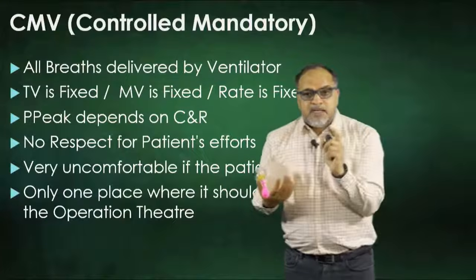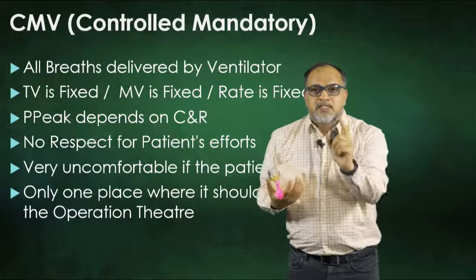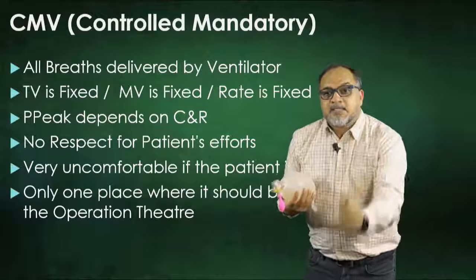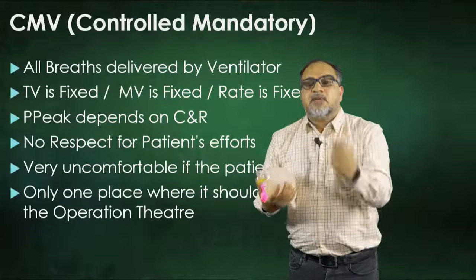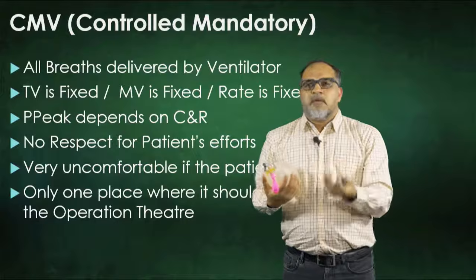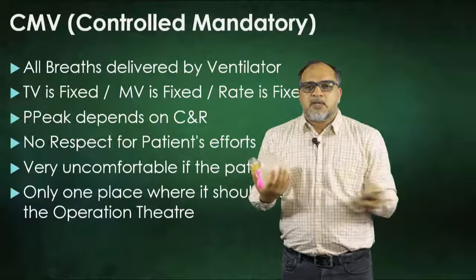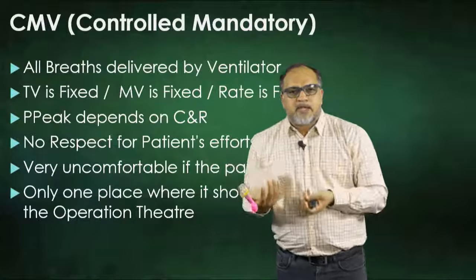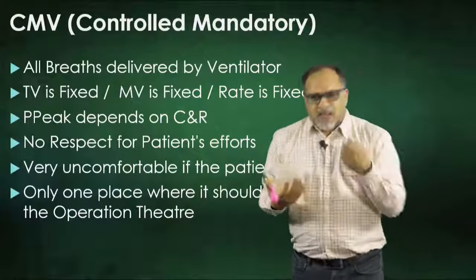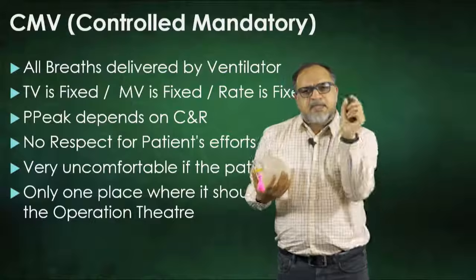The only place where it should be used is the operation theatre, because we sedate and paralyze our patient and we control every breath. In ICU, CMV should be given maybe to a person who is completely comatose and probably not going to wake up anytime soon. Otherwise, CMV shouldn't have a place. Nowadays, they don't even have a separate CMV.